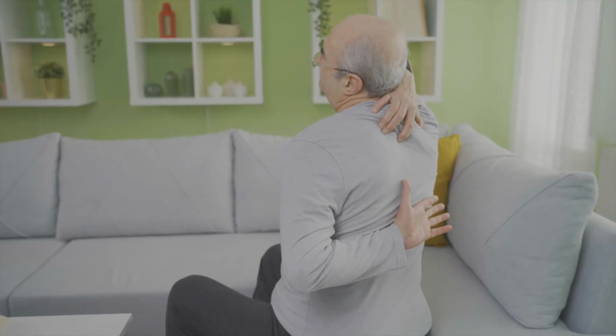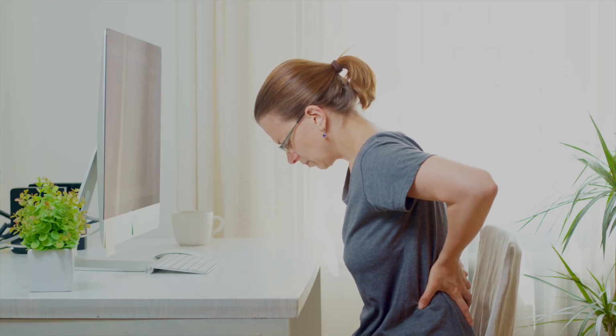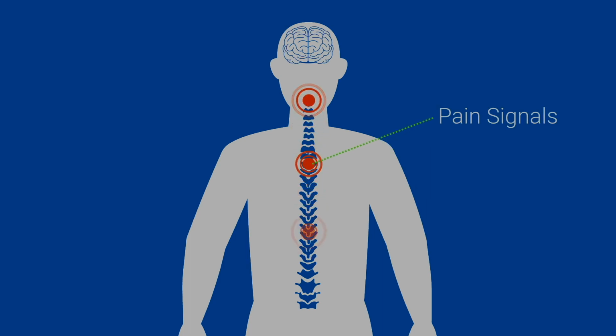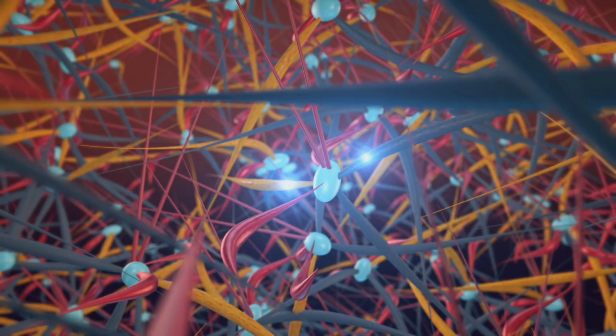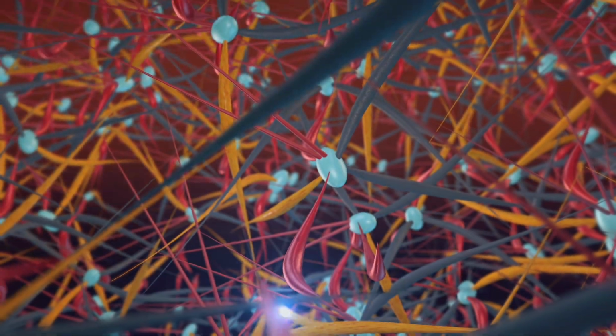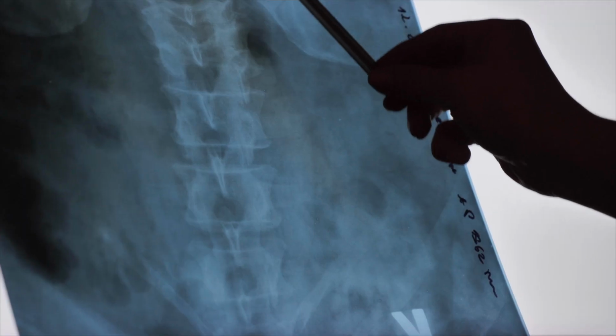If you have chronic back pain, in fact, you may have already had 1, 2, 3 or more back surgeries and you're still in pain, there is a solution out there for you, and it's often spinal cord stimulation. It involves a small stimulation wire, much like a pacemaker wire that people get put on their hearts. We can use similar wires to send electrical signals into the spinal cord. It can interrupt or interfere or change the way that pain signals are processed.